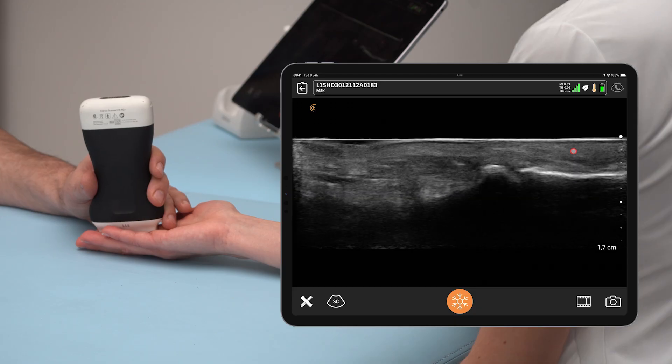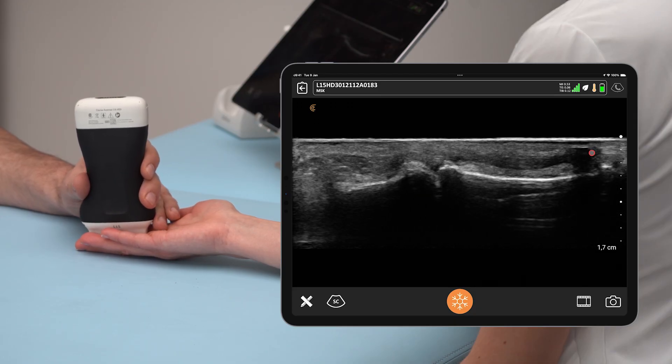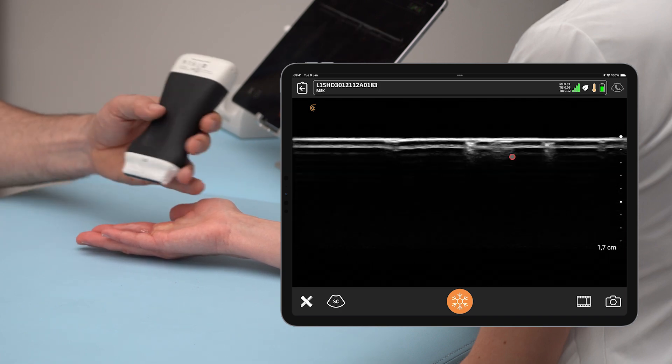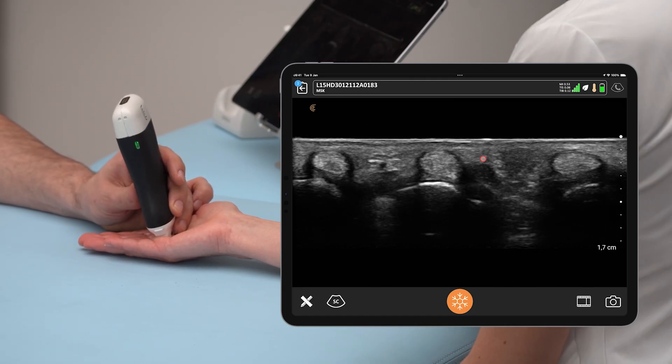Of course, beyond the A1 and A2, we can also look at the A3 pulley, the A4 pulley, and finally the A5 pulley over the DIP joint. After checking the tendon-to-bone distance in the longitudinal view, we can also assess this in the transverse view.